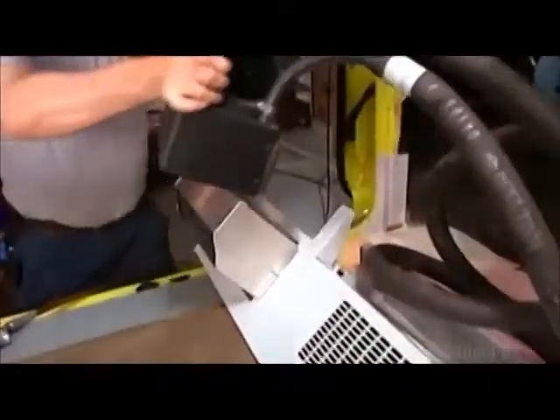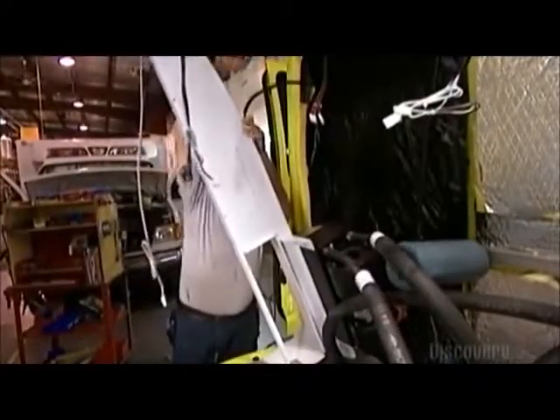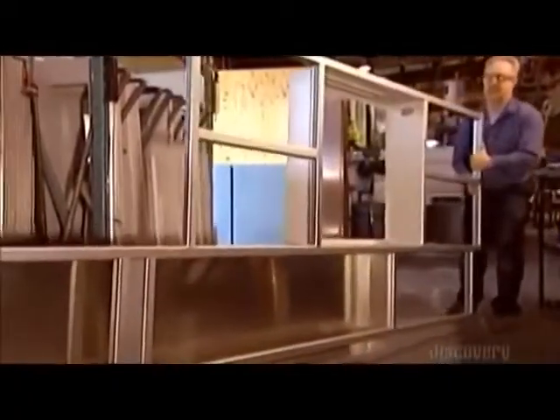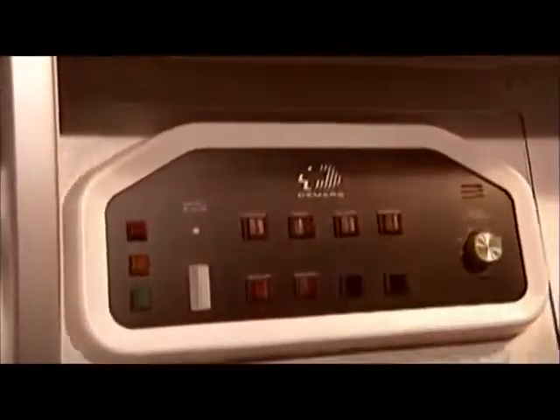The heating and air conditioning systems in the original truck aren't strong enough, so the ambulance factory adds an extra system of each to work in tandem with the existing systems. The frame of the medical cabinet is made of aluminum, a metal that's lightweight and therefore won't weigh down the vehicle. The cabinet shelving is made of either plastic or fiberglass. It's molded to the contour of the vehicle, maximizing storage space.